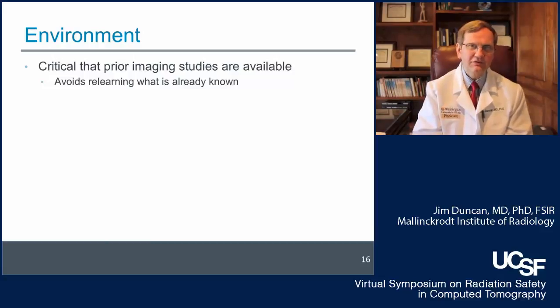An example that we've heard from MD Anderson is that they're no longer using DSA acquisitions prior to filter placement. They've recognized that a recent CT can tell where the level of the renal vein is. It also allows them to define IVC anatomy, and they can really go with just fluoroscopy only during a simple IVC filter placement.